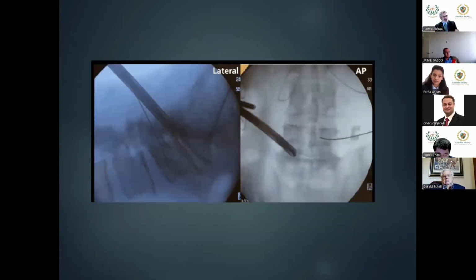You have to make sure that your trajectory is fixed in the method you want. You have to be a master of this instrument. And then you drill while stimulating under 10 to 12 milliamp the whole instrumentation. And you drill, and you're in the axilla of the L5 nerve root and the S1.